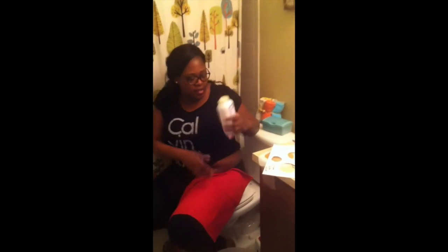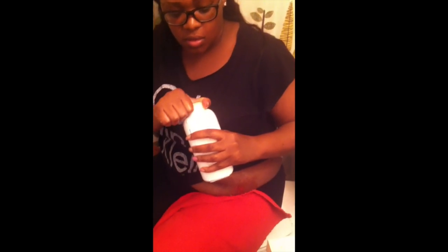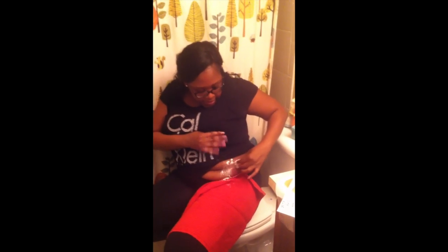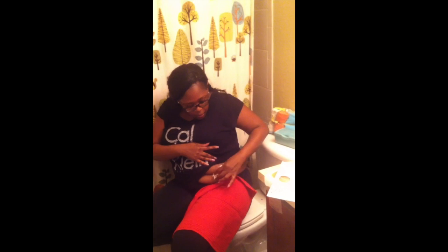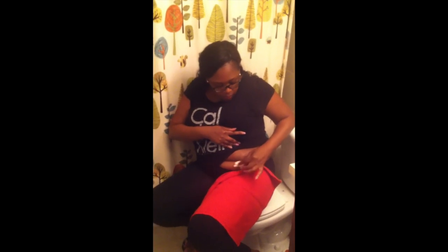How do you protect the skin around the stoma? I'm going to use the stoma powder. Just sprinkle it on your skin and then use one of the gauzes to wipe it off to the point where it looks like there's nothing there — basically keep wiping until most of it wipes off.